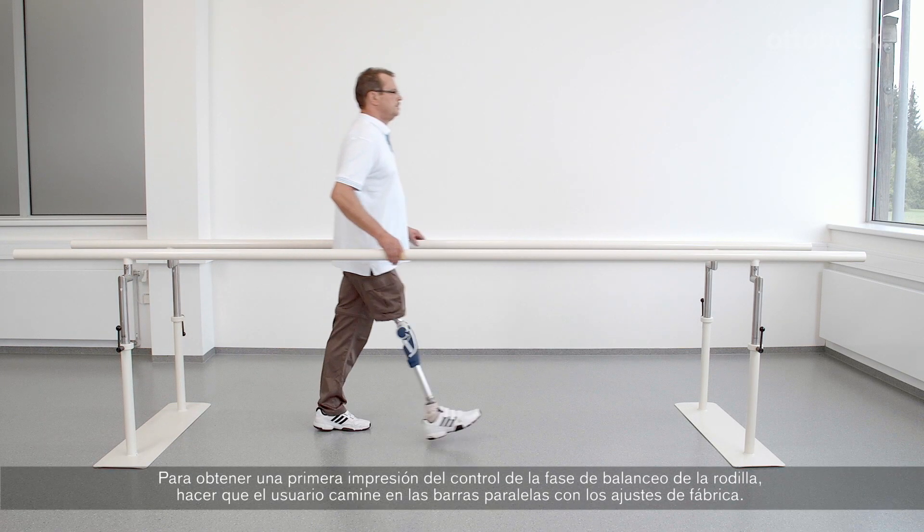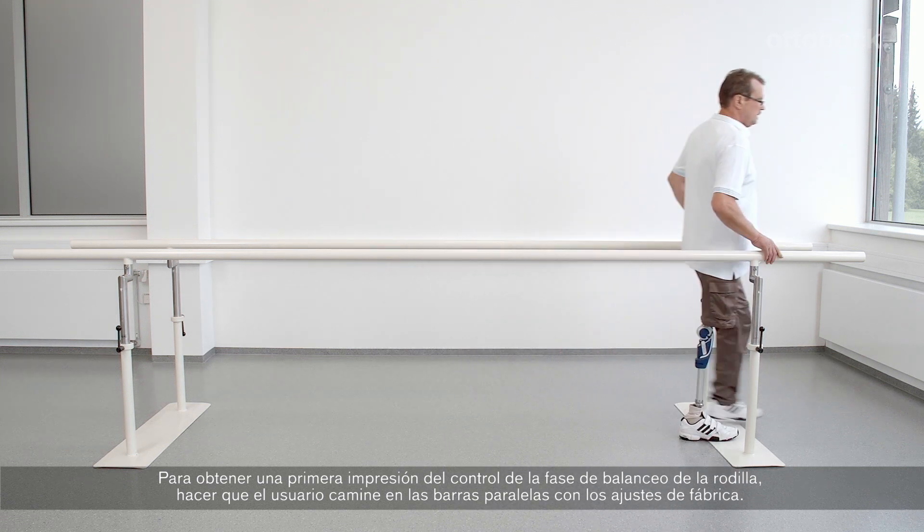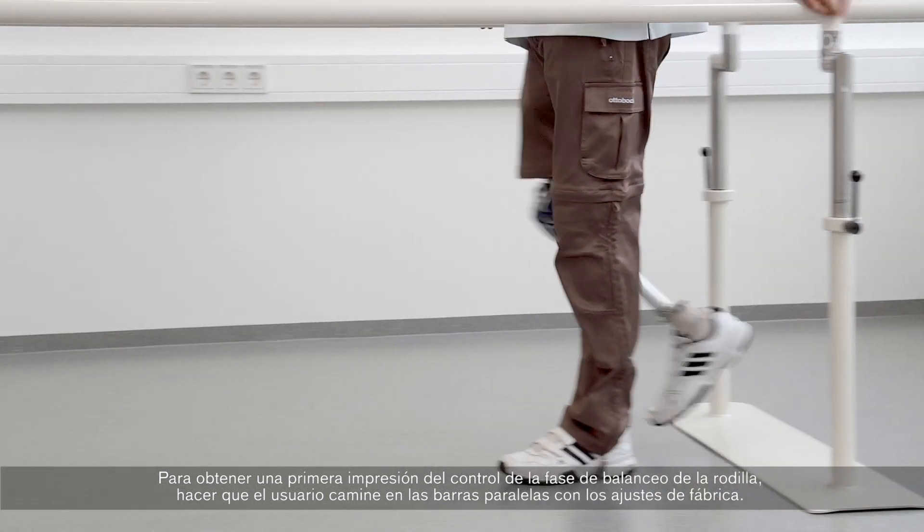To get a first impression of the knee joint's swing phase control, let the user walk in the parallel bars with the factory setting.